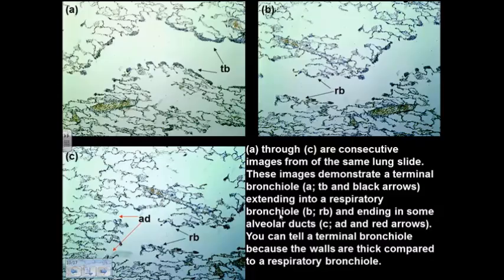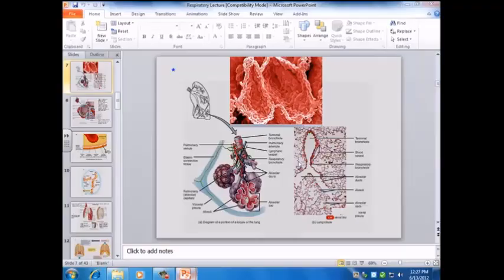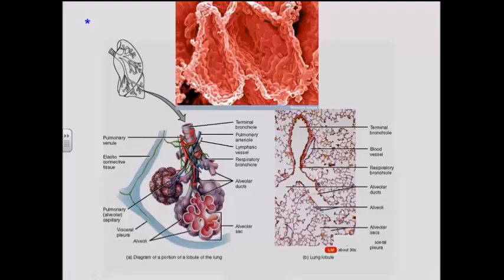And then it leads into, here's the same respiratory bronchiole down here, then it leads into the ducts, alveolar ducts. Okay? So that's where this is incorrect then. This says this is a respiratory bronchiole and it's not. This is a terminal bronchiole and then this down here is the respiratory ducts. So again, the A&P textbook's screwing it up.